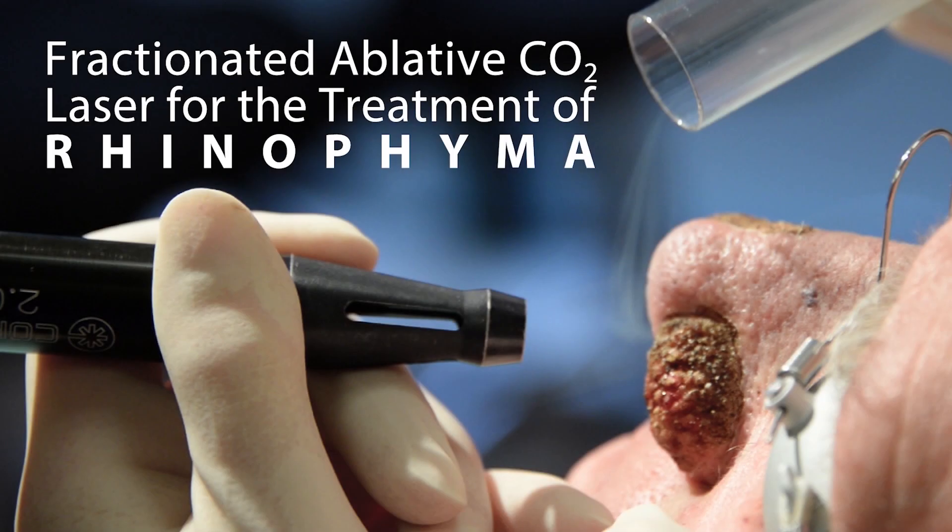In this video, we will be discussing the use of fractional carbon dioxide laser for the treatment of rhinophyma.